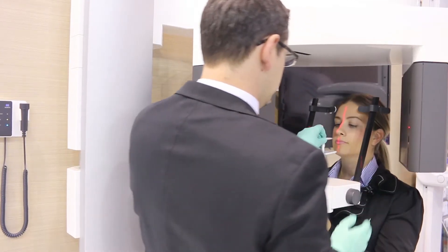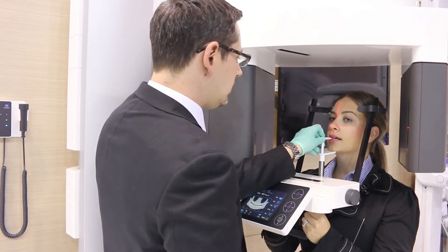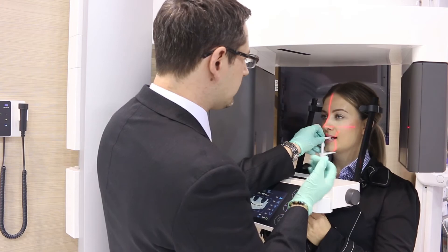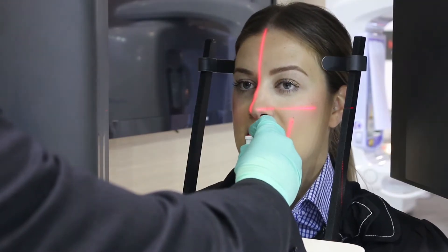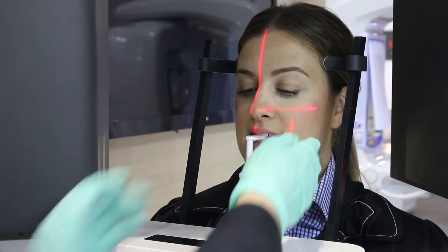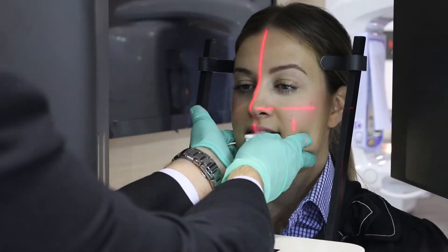Now adjust the height of the X800 patient arm so the chin rest is slightly higher than the patient's chin. Assist the patient to bite their upper and lower incisors on the groove of the bite stick to ensure an incisal occlusion.